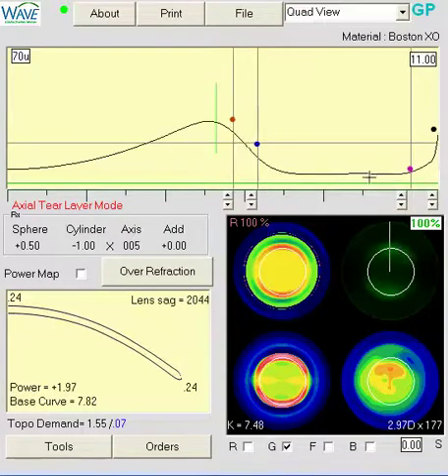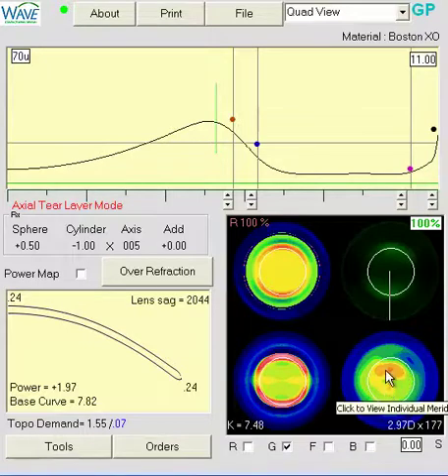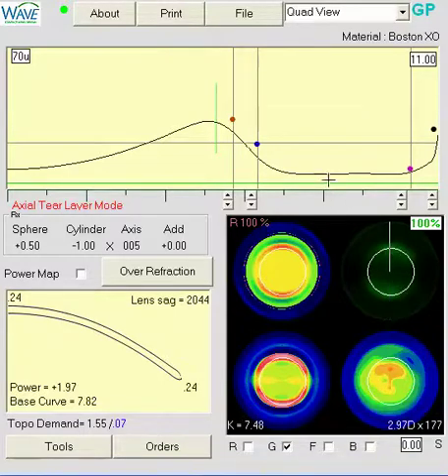And bear down. You do see a little bit of clearance superiorly and inferiorly, and I'm not sure if that's a component of the topography. If this irregularity in the topography is just from tear film or perhaps eyelid position, then it's okay to have a little bit of clearance. If this appearance in the topography is true, the cornea does have superior ectasia to it, then you just have to be careful.